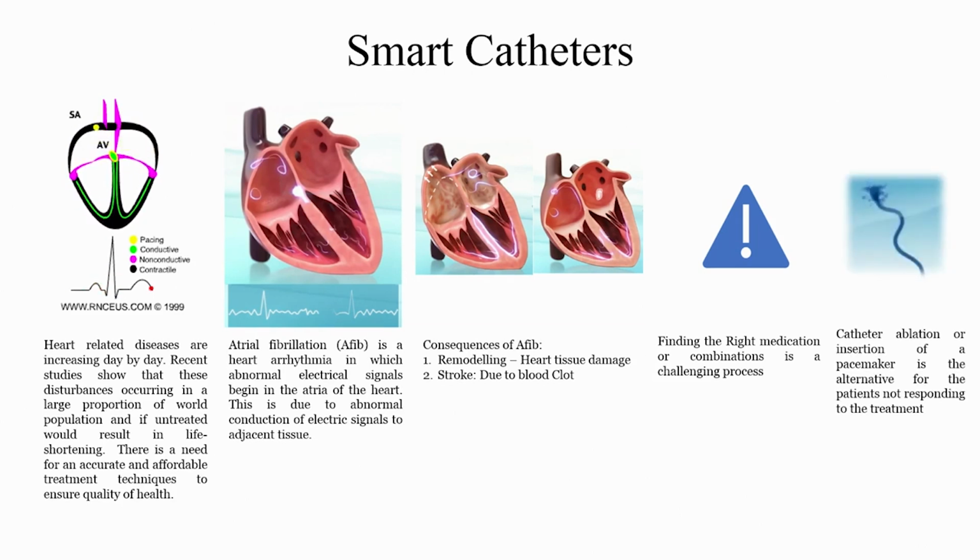And when you talk about treating it, the surgeon will insert a catheter and will ablate the tissue. We will talk about this after a video, so that whatever I am talking about you will get it. So, let me play the video.